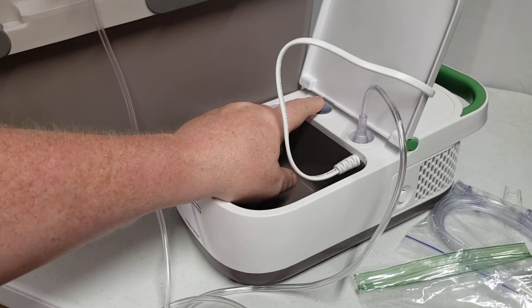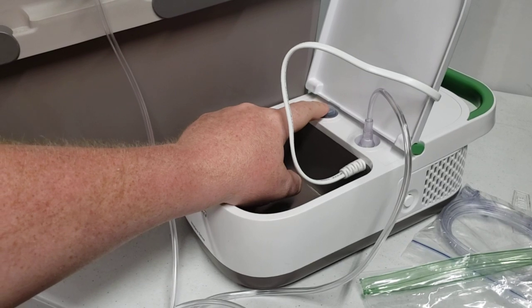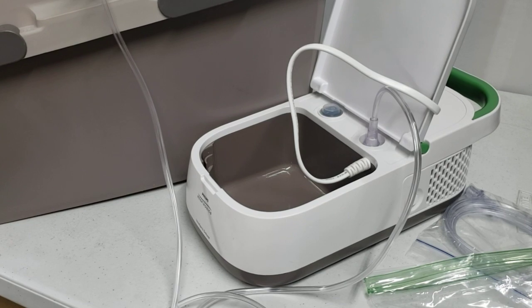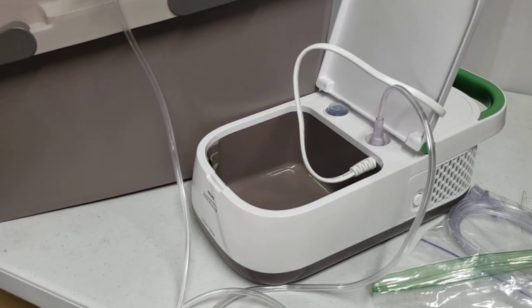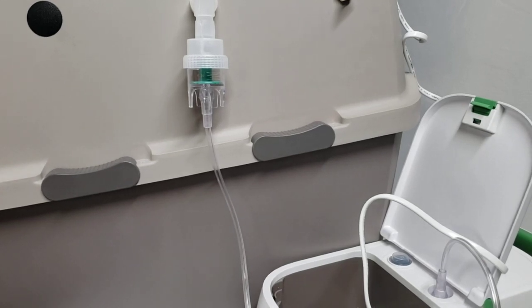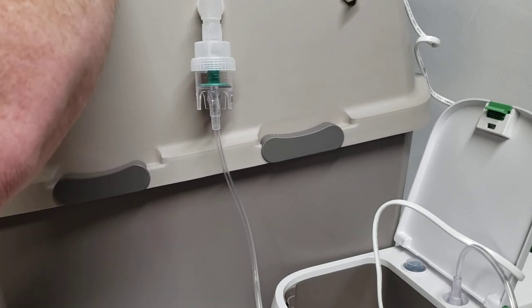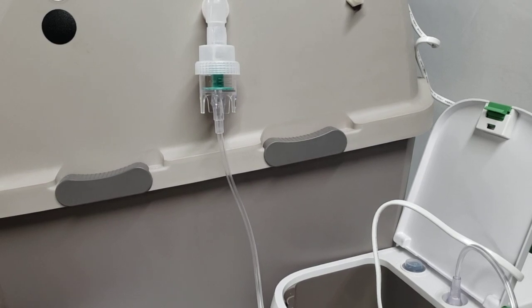Go ahead and turn your pump back on. That is going to pressurize it and force the contents of your cup into the unit. Make sure that you have the unit door closed securely in the front and latched, so that the animals inside the unit are just breathing that in comfortably and they don't have to be masked.